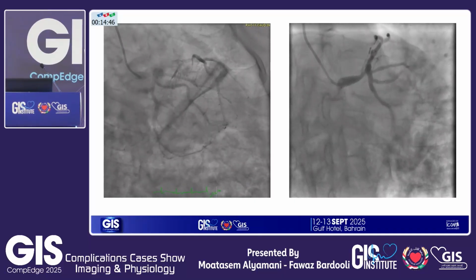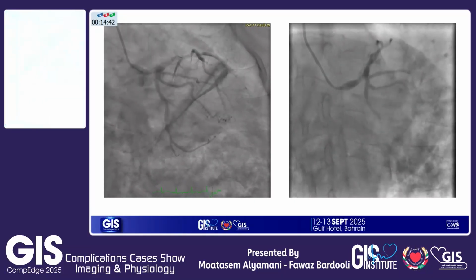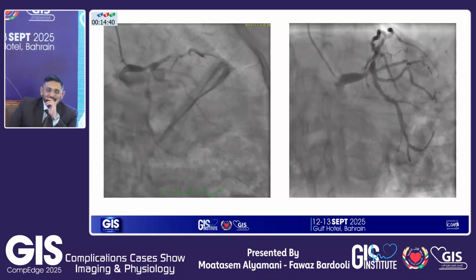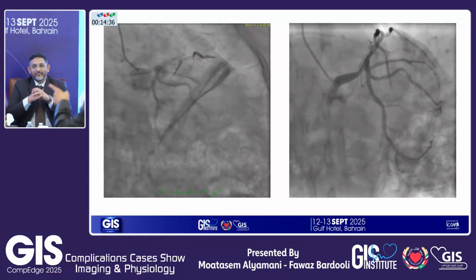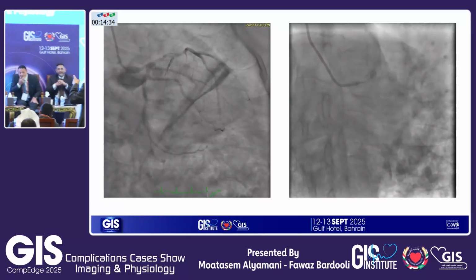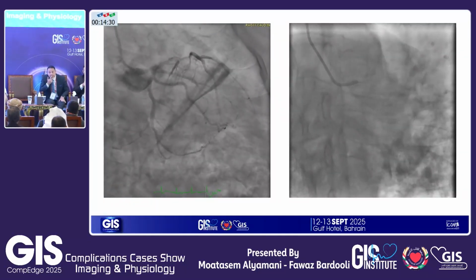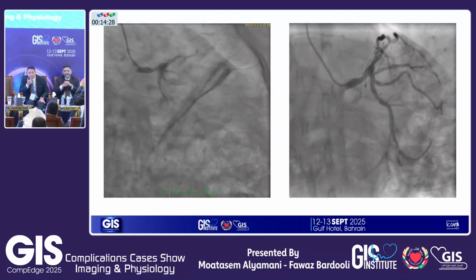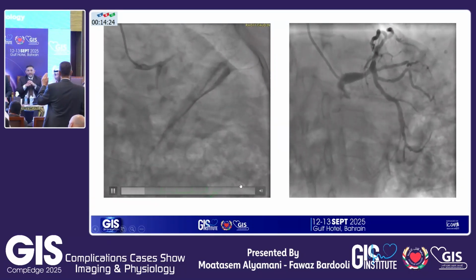Yeah. Let's hear Dr. Tariq here. Yeah, I mean, practically, typically in any cath lab, not in the conference, you're going to get people calling for a surgeon for an opinion. The lesion is hazy, so definitely we are underestimating angiographically. This is an eccentric plaque. You can see at the background, actually, before just the injection of the contrast, there's significant deep calcium.